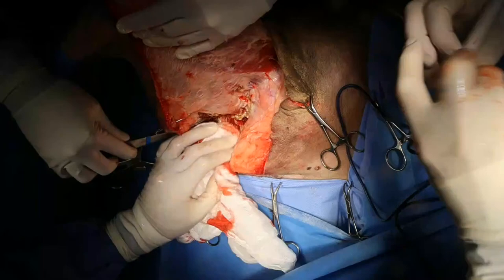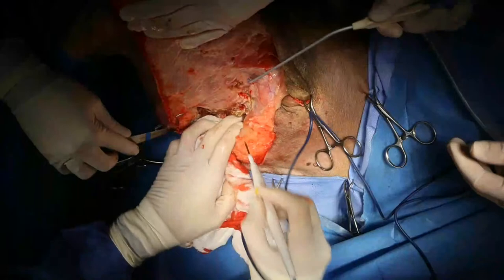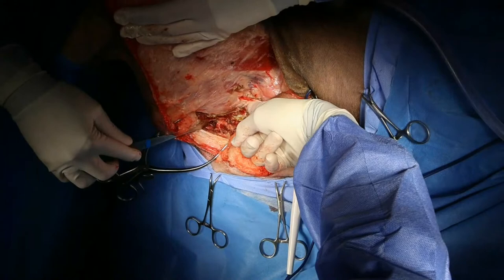Now it'd be a big ask to ask Sean to stick his finger in there. And so I will use my own finger. It also helps me to direct the blade. So I've got my finger in there now. Yeah, that's great.